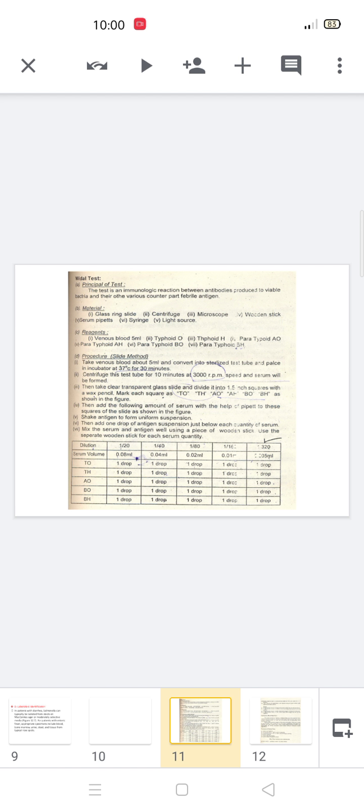We can perform the test on stool examination in the first week if we suspect that the patient is suffering from salmonella as well as salmonellosis. So first is the microscopy, which we discussed with you. Second is the culturing method. So we culture the stool or the vomitus of the patient on different types of culture media.